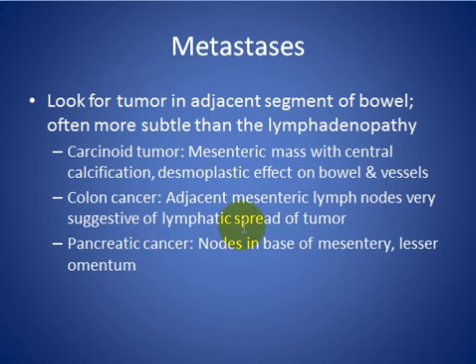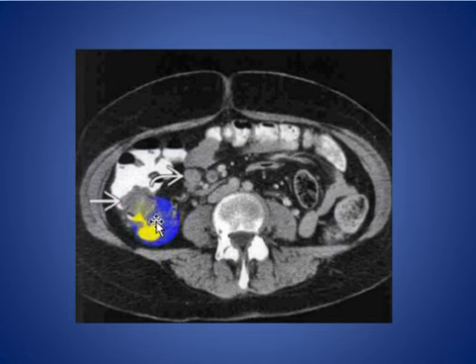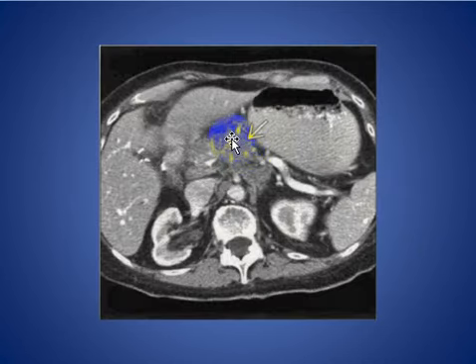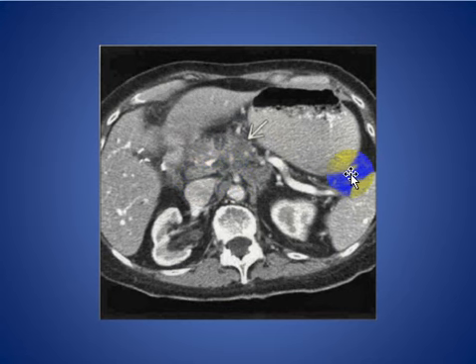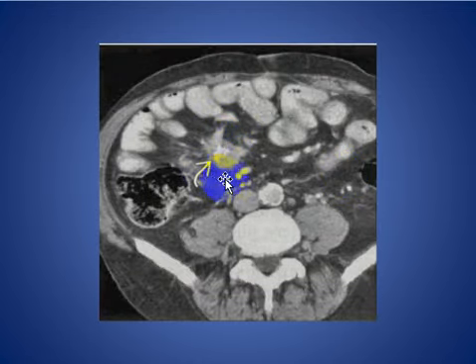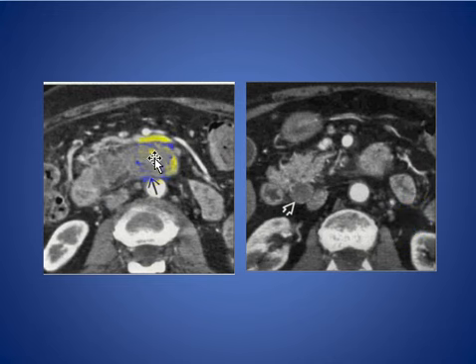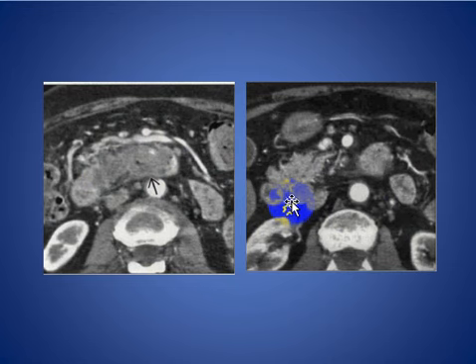Pancreatic cancer nodes at the base of the mesentery and in the omentum are usually seen. Here you see a patient with cecal carcinoma and mesenteric lymph node adjacent to the tumor. Here is a patient with pancreatic carcinoma with lymph nodes at the base of the mesentery. Here is a patient with carcinoid tumor associated with central calcification and desmoplastic reaction of the bowel and blood vessels. Here is a patient with duodenal carcinoma filling the duodenum associated with low-attenuated lymphadenopathy behind the pancreatic head.